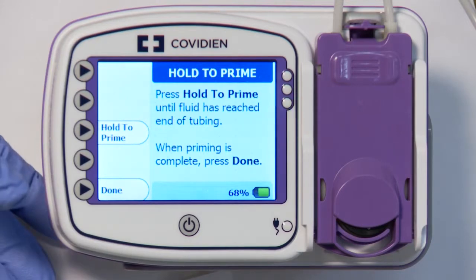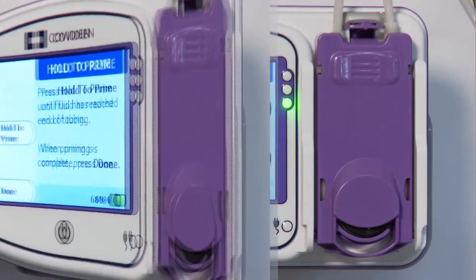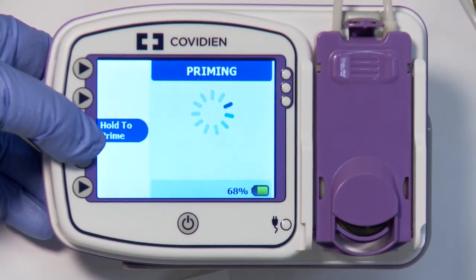If desired, Hold to Prime can be used instead for a manual prime. Press and hold the Hold to Prime button to begin the manual prime. Press Done when complete.